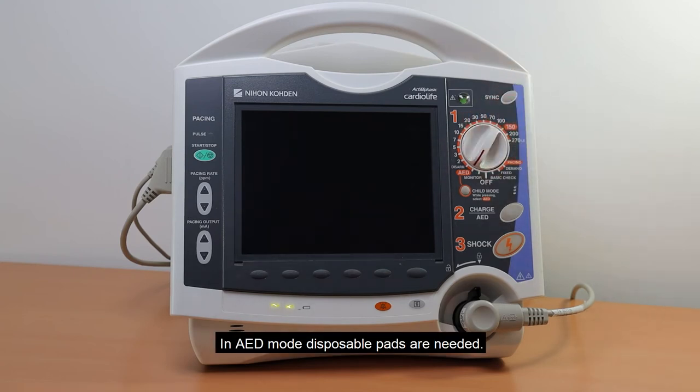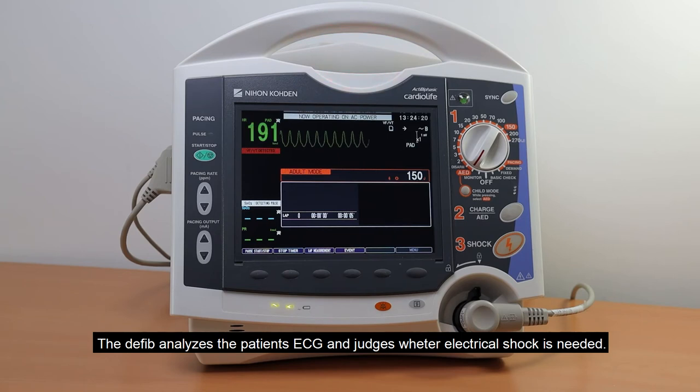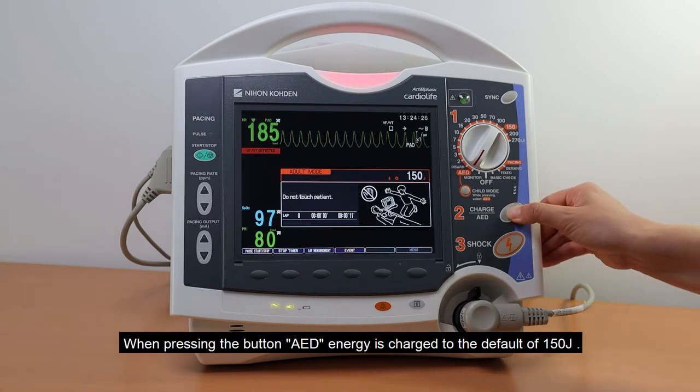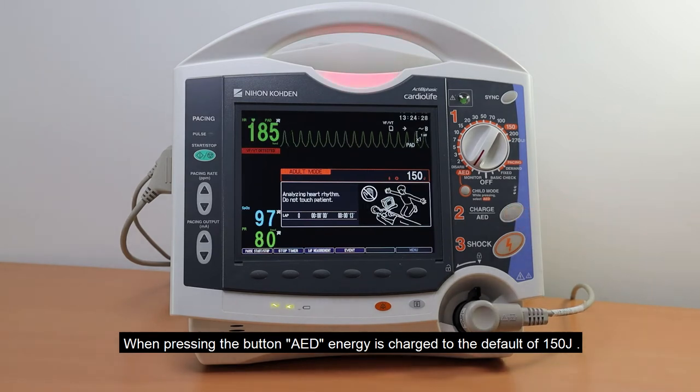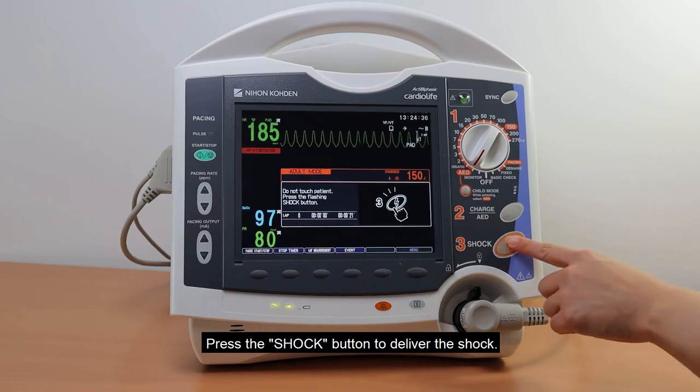In AED mode, disposable pads are needed. The device analyzes the patient's ECG and judges whether an electrical shock is needed. When pressing the AED button, energy is charged to the default of 150 J. Press the shock button to deliver the shock.